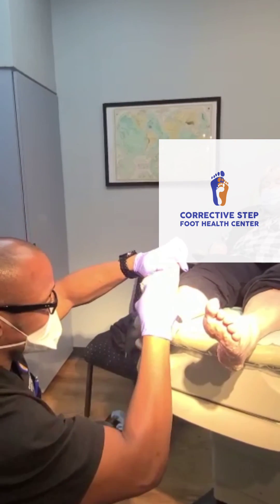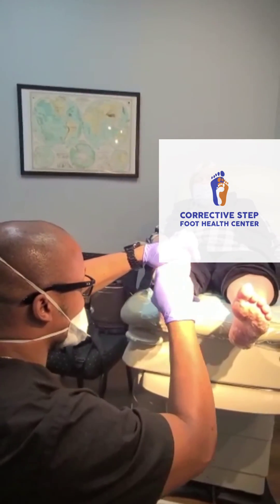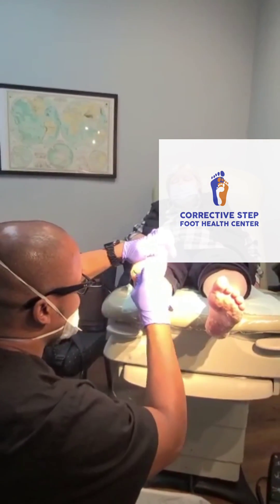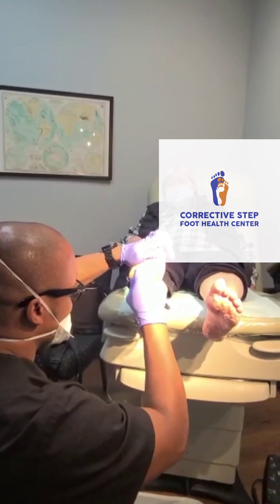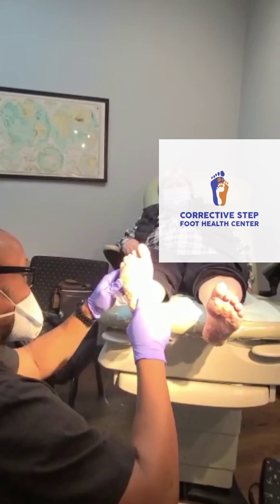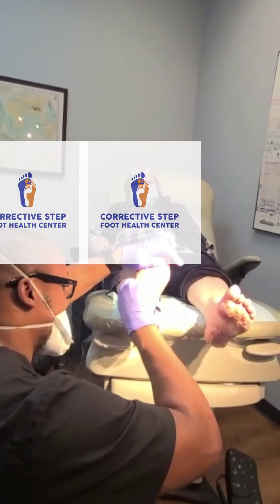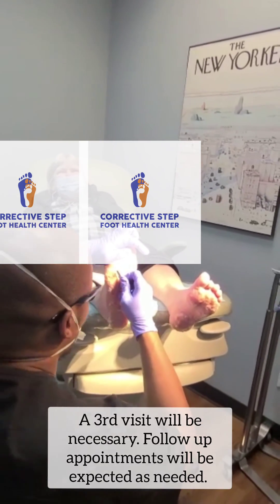You can see how soft these lesions are and they're coming off with the 10 blade. Last week this was not as simple. But like I said, we may be able to get a good portion of it all today and then next week have you come in for a little more.